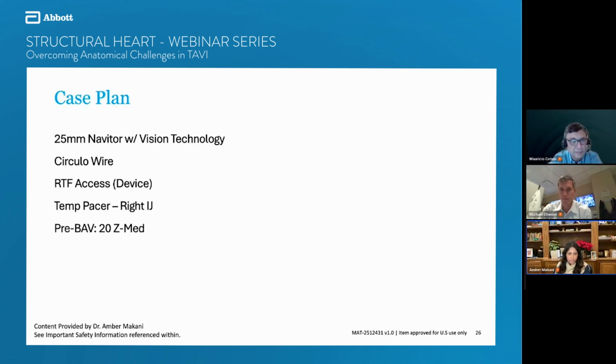So we chose a 20. In this case, we had chosen a Z-Med. We've since gone to a non-compliant way of doing things, so we have transitioned to using true balloons primarily now. All right, next slide, please.